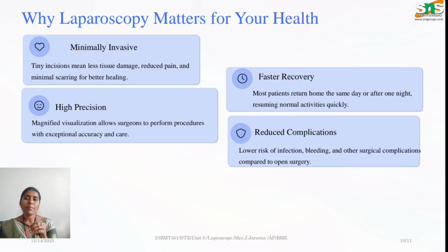But in the case of laparoscope, we have to make a very small incision with very little tissue damage, so there is not that much pain or complications compared to open surgery. We also have high precision, a very small incision and magnified visualization, so it is very much recommended. We can easily access the targeted area and visualize the in-depth part of the internal organ.